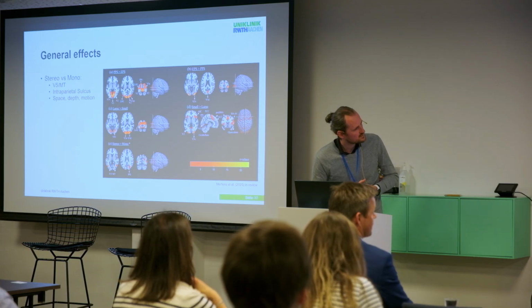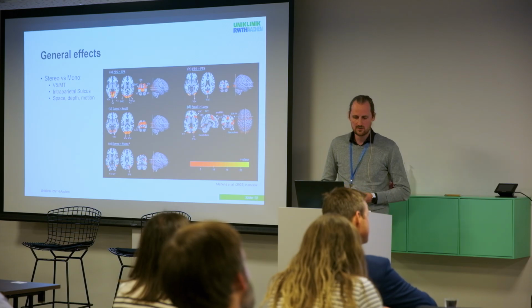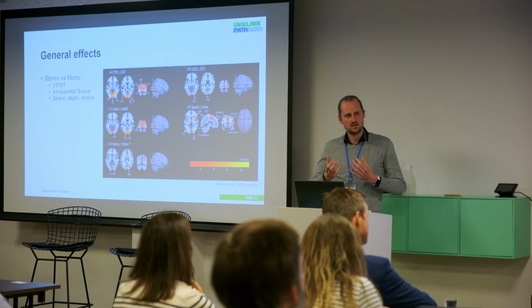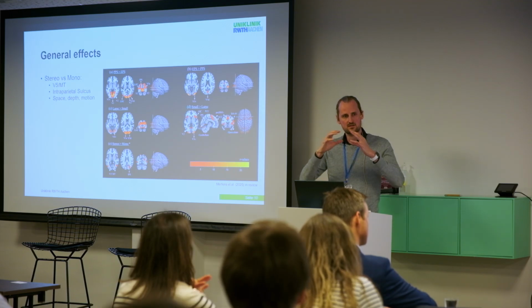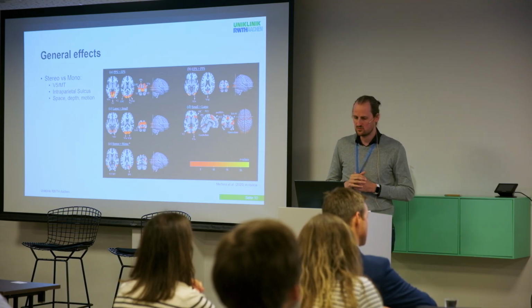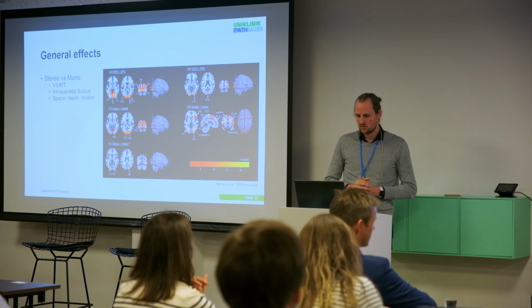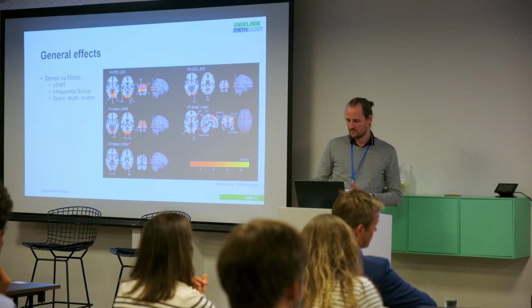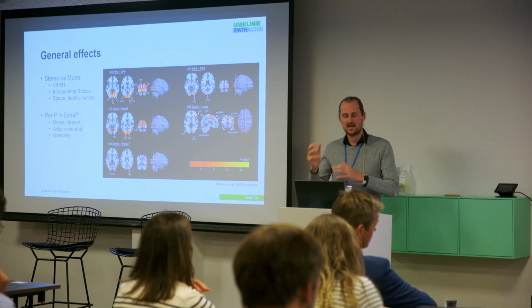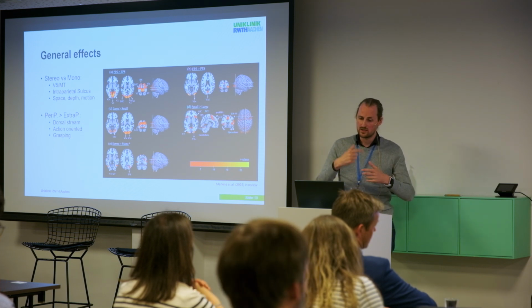A keen eye might notice, in the bottom left, that the t-values are not extremely high for this contrast, which kind of makes sense. We didn't present a full VR stimulus, we presented a 3D stimulus. So we found some effects, but the effects were not huge. I think we didn't find an interaction with our task actually. But all in all, we got what we wanted. Mainly interesting was the comparison between the peripersonal and extrapersonal space. So this far away compared to close by. Actually, all the way around.